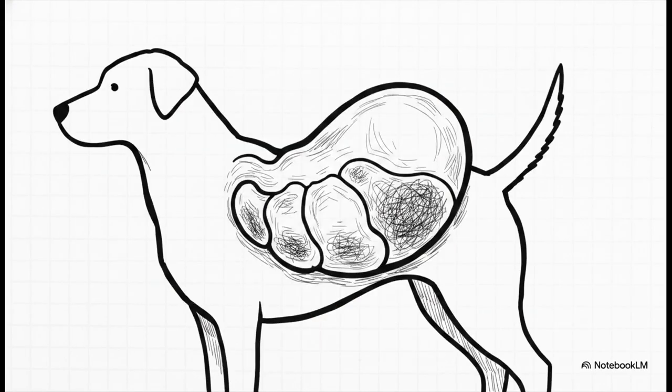Then, of course, we have massive emergencies like gastric torsion. This is where the stomach twists and bloats incredibly fast. On the film, it completely overtakes the anterior abdomen. It presents as this huge, greatly distended, gas-filled shadow that actually shows clear compartmentalization of the stomach. It's a very dramatic, very urgent radiographic sign.